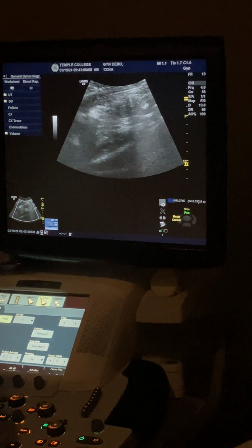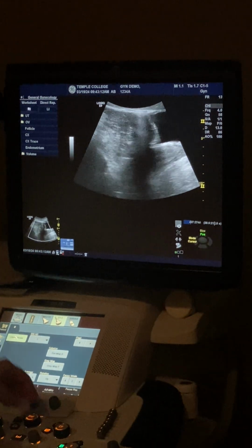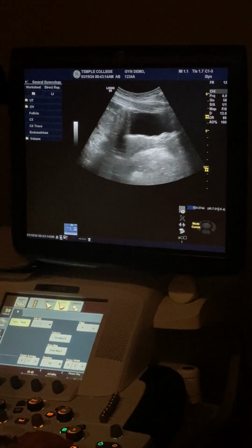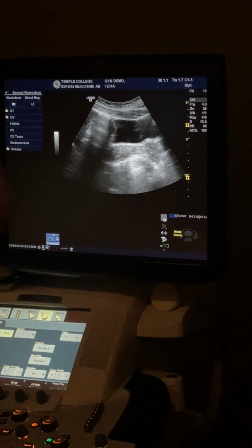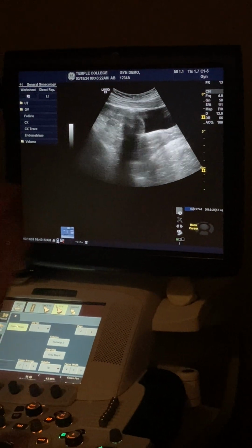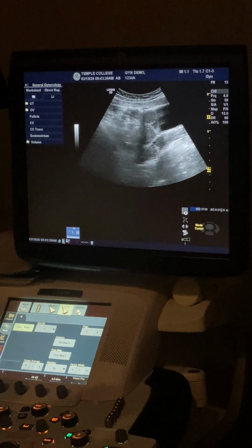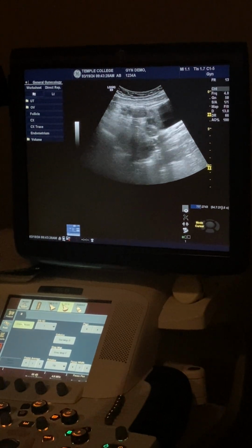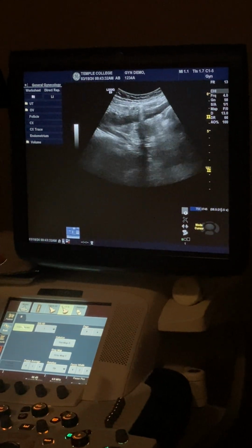Yeah, show iliacs with color. Okay, so your iliacs sit, there we go. So this is midline here. The adnexa is the space between iliacs and uterus. That is what that space is defined as. So when we're evaluating the adnexa, the ovary lives there, bowels live there. We need to make sure no other things live there. No masses are hanging out, no cysts, no fluid collections, nothing like that.